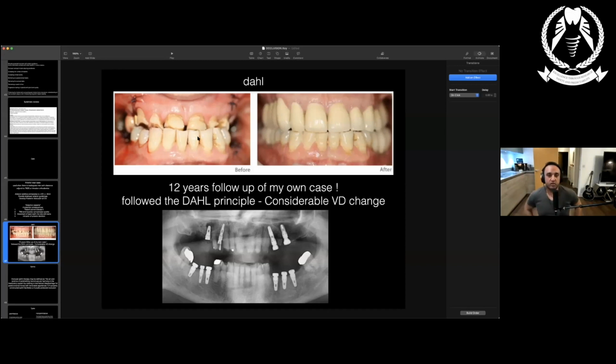I don't like them. They were tombstones that he'd ground down. And he was very class 3. So again, looking at principles of the protection of the incisal edges when they come together, he had none of that, right? So we crown lengthened at the front teeth, right?